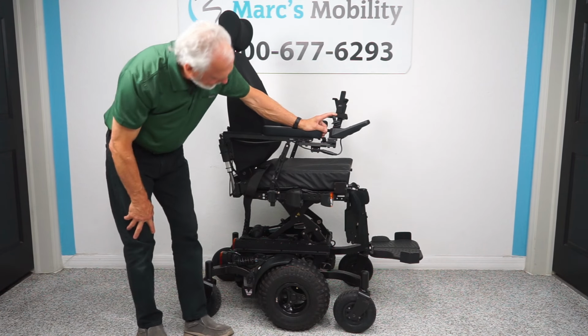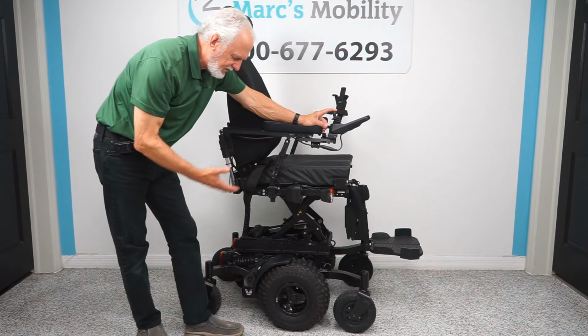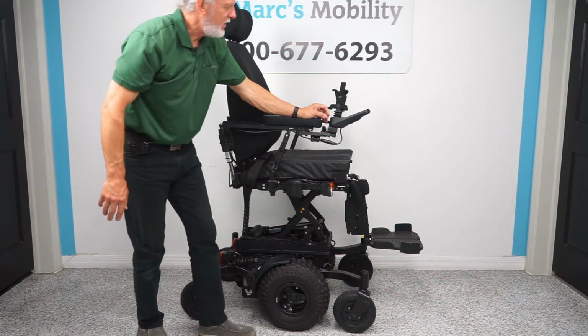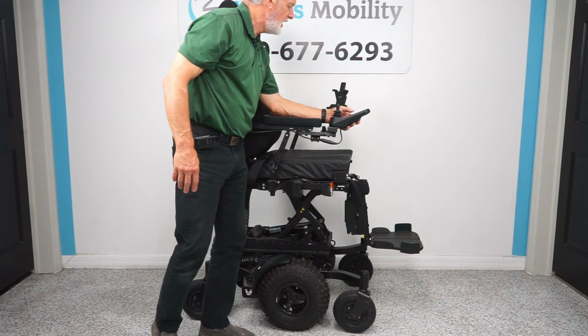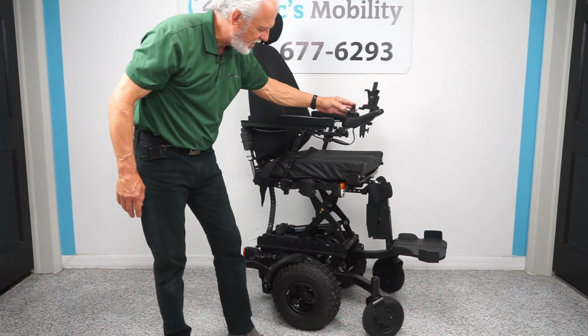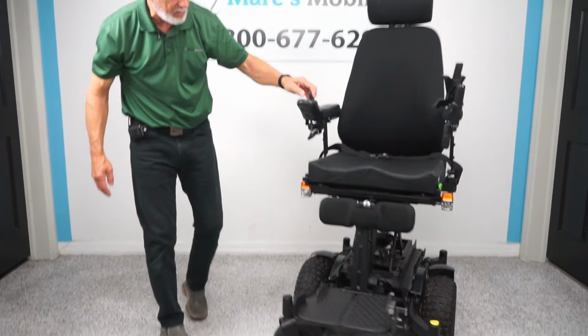It's a slow riser seat lift, and you can see you can't even hear it. It's almost all the way to the top. And when you're at the top, the chair will still drive with the seat elevated. So a lot of these chairs will not drive with the seat elevated, but this one will, okay?